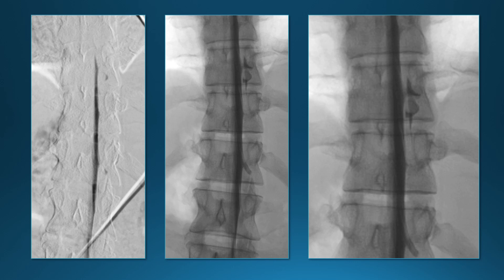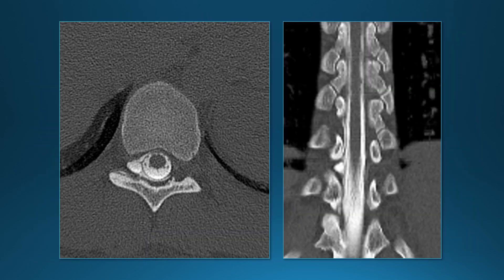On digital subtraction myelogram, early images show some accumulation of contrast in the region of one of the root sleeves, and a later image shows more accumulation — myelographic contrast accumulating outside of the thecal sac, indicating the site of leak along the root sleeve. On CT myelogram, this is the dura, and this is the contrast accumulating outside the dura at the site of the CSF leak, shown here on coronal images.